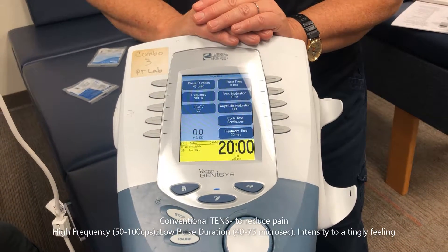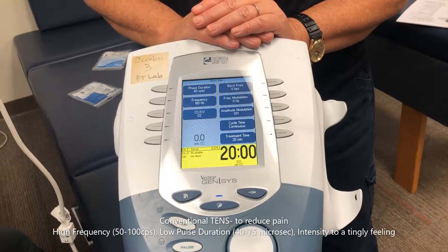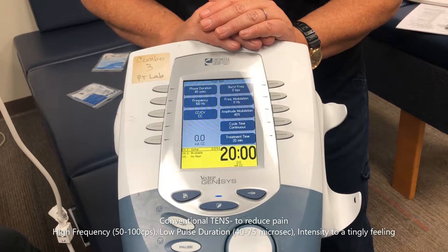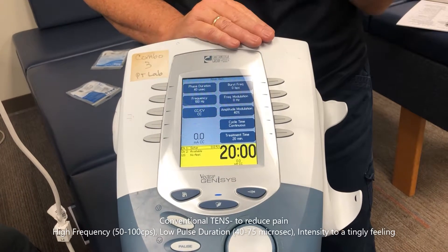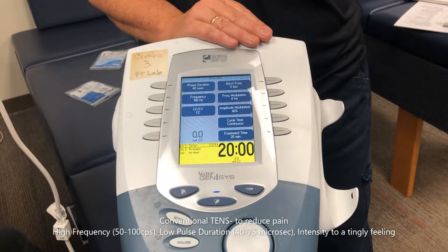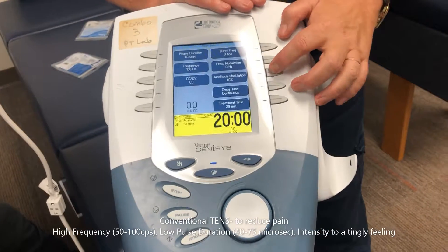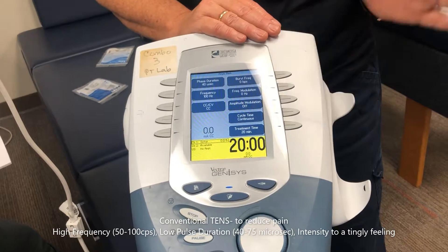Amplitude modulation — you learned that from medium frequency. Basically, you set the intensity and it cycles up and down so your body doesn't adapt to it. I'll leave that off for now.